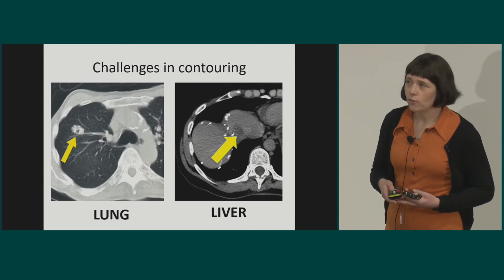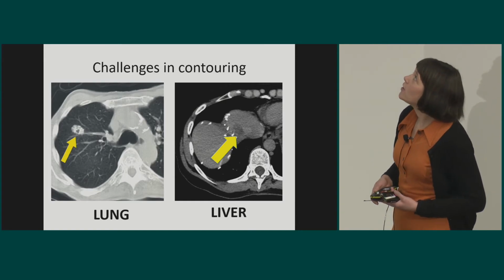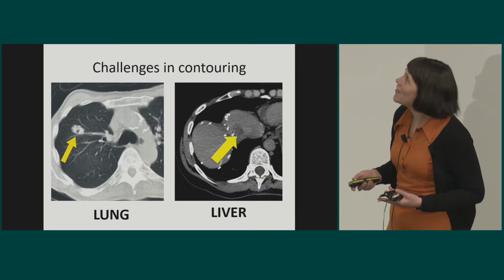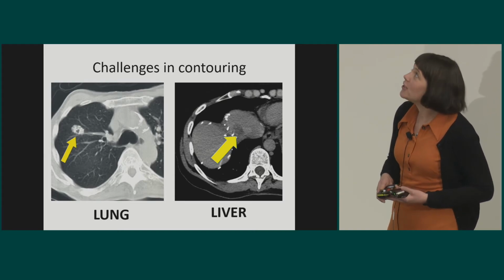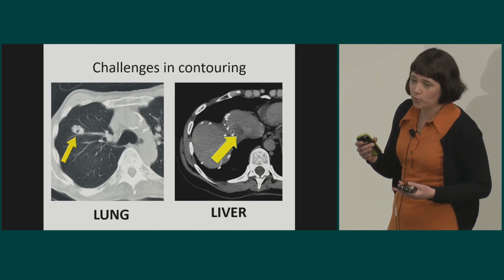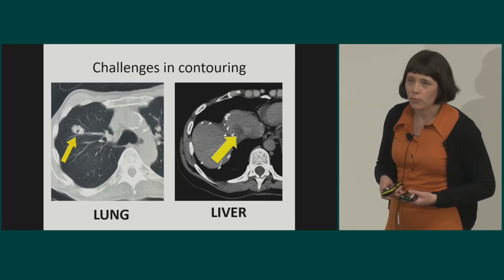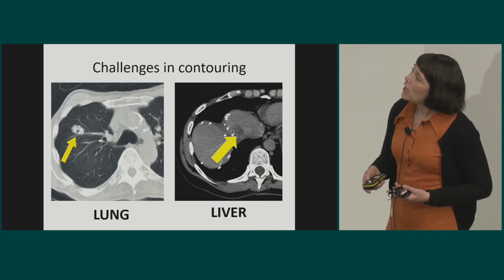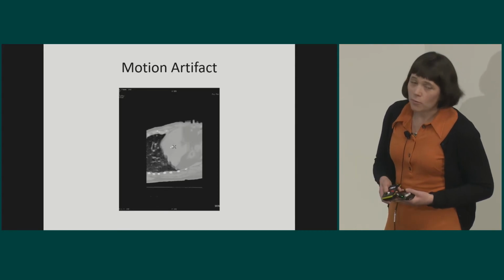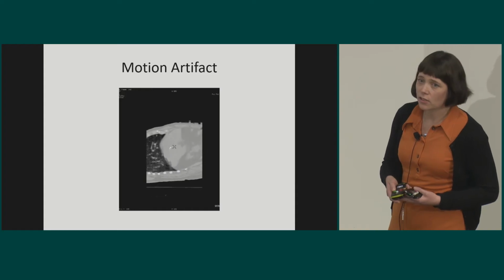Bowel filling, as Uwe showed earlier. I mean, people have bowel motions every day, sometimes more than every day. And how can you know, when you're treating these patients, what their liver is going to be pushed by, whether it's stomach or bowel? We see it every day in the clinic, where we have trouble treating these liver patients. And also they move with respiration. So this is another problem, and this also gives artifacts in a lot of the images.